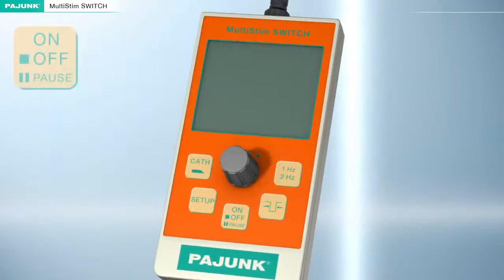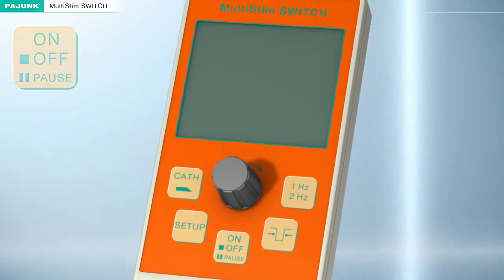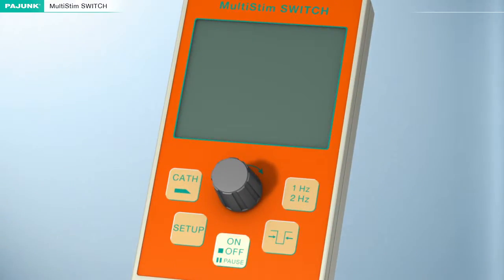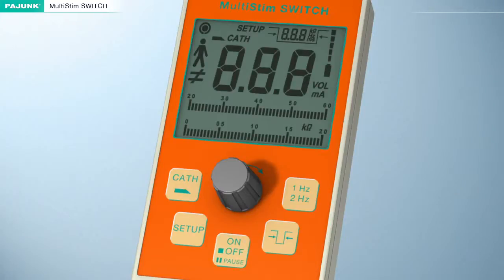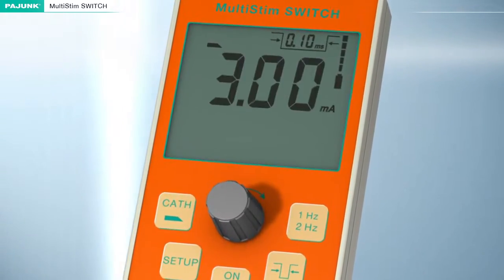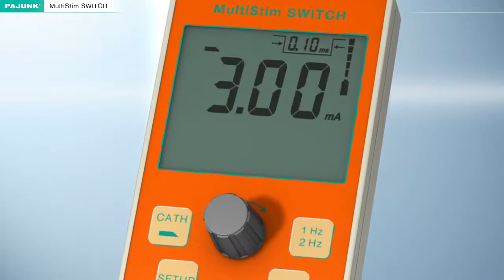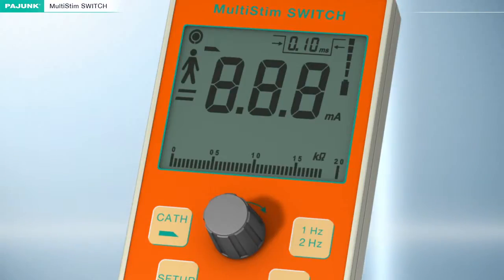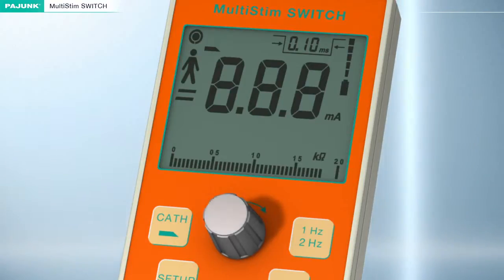On, off, pause key. Press and hold the on button to start the device. The device will then automatically initiate a self-test sequence, then switch to pause mode. The LCD display will start to flash. Depressing the turning knob will deactivate the pause function; repressing will activate it.